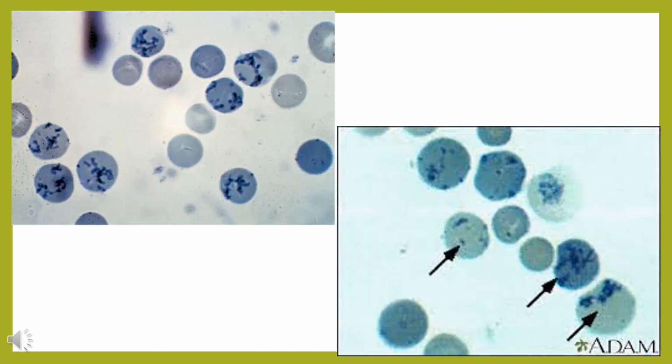Okay. In this slide, you can see your reticulocytes stained with your new methylene blue. So they are very distinct. You can see them very clearly. They have parang may mga laman sila sa loob, parang granules sa loob. So that's how you identify them. That's how you count them.